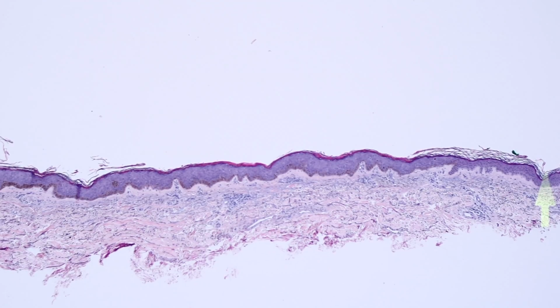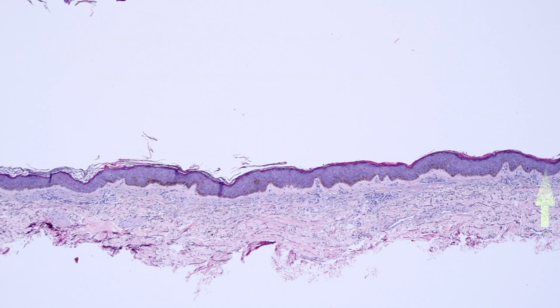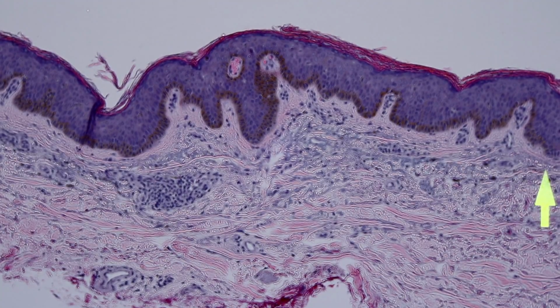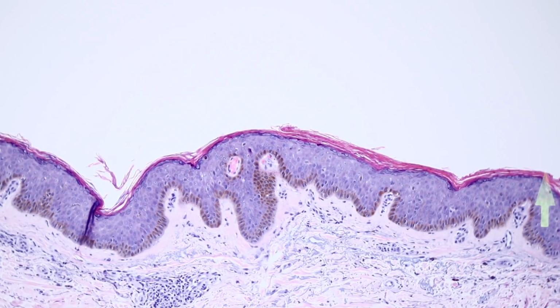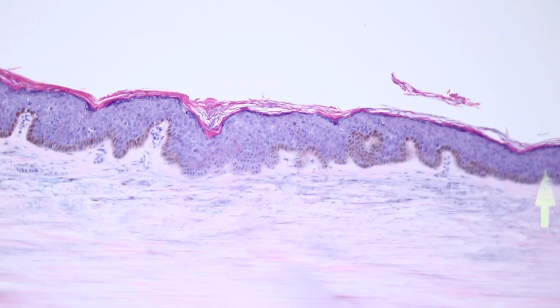That'd be easy to miss. So I feel like anytime I see just kind of this darker, hyperchromatic, hypercellular epidermis, I go look closer. Sometimes there's certain sebs that I'm like, it's probably just a seb, but it looks kind of too blue from low power, so I go closer to make sure. And usually once you're closer, you can easily see, oh yeah, there's atypia there. I mean, real pros maybe can do it always from low power, but a lot of times I feel like I need to check a little closer for a second just to make sure and look around for a bit to make sure that I'm not missing something so that I can sleep at night.